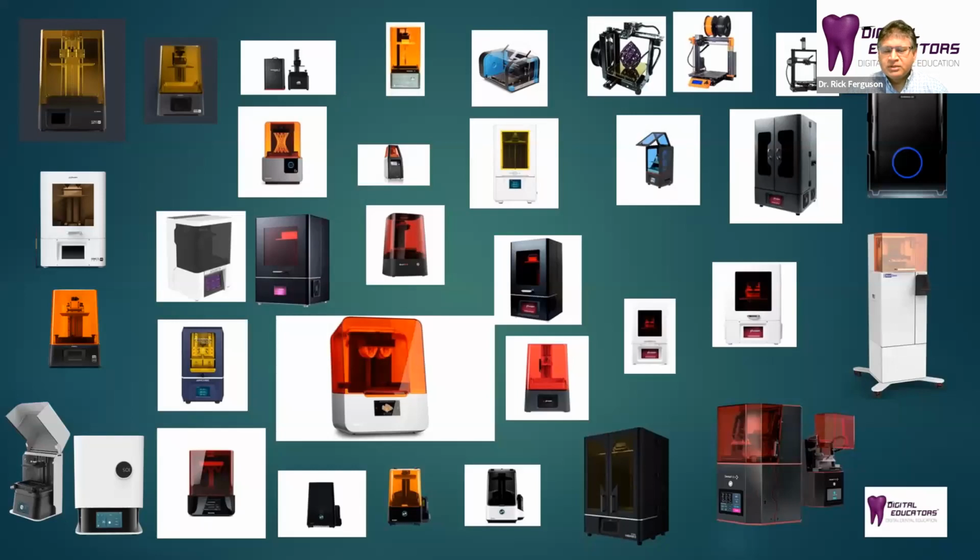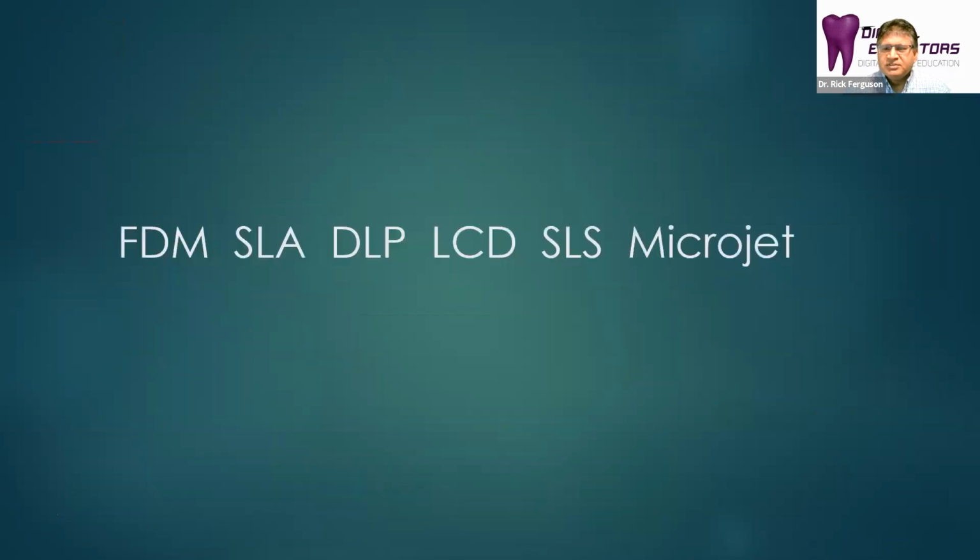And so I just want to go through a few of the printers, our current lineup of printers, so to speak, the ones that I am currently using. And that, of course, changes from time to time. But you'll see that if you've seen my past presentations, there are some brands of printers that are still with us that we still use every day, and those are our workhorses. And you saw those on the previous slide.